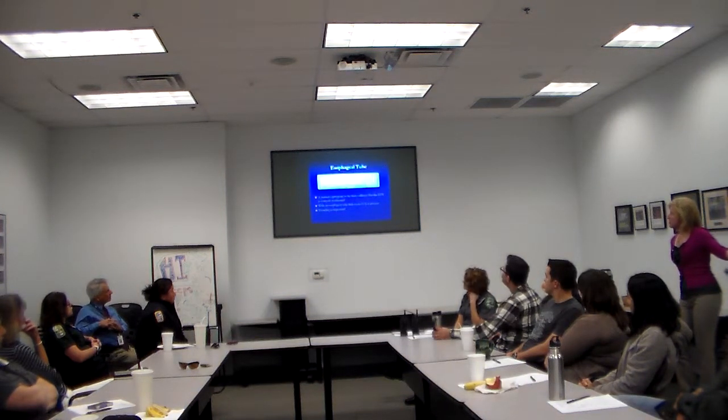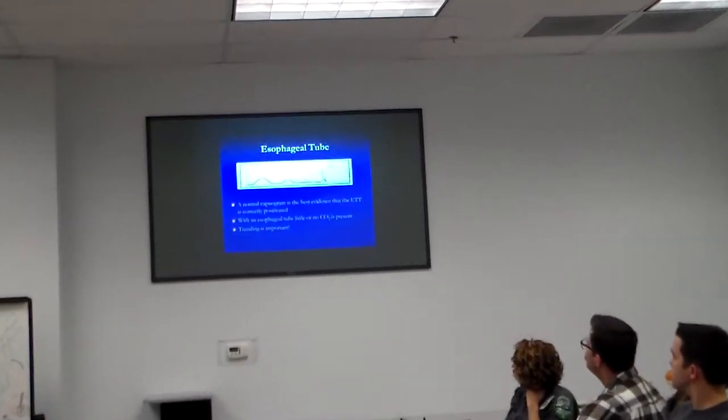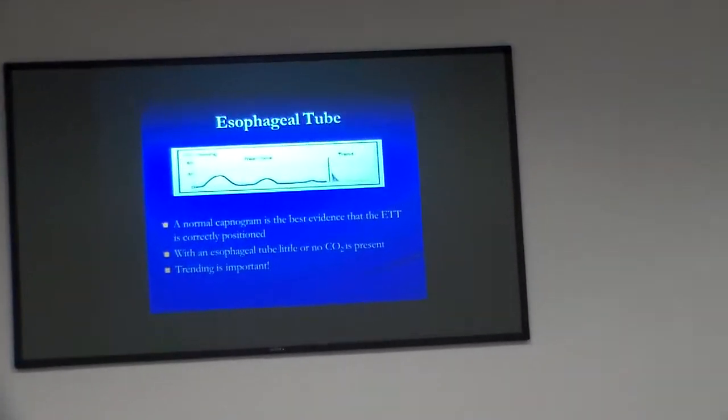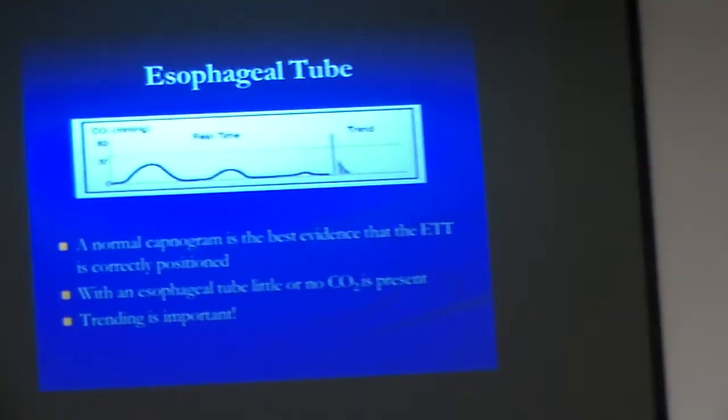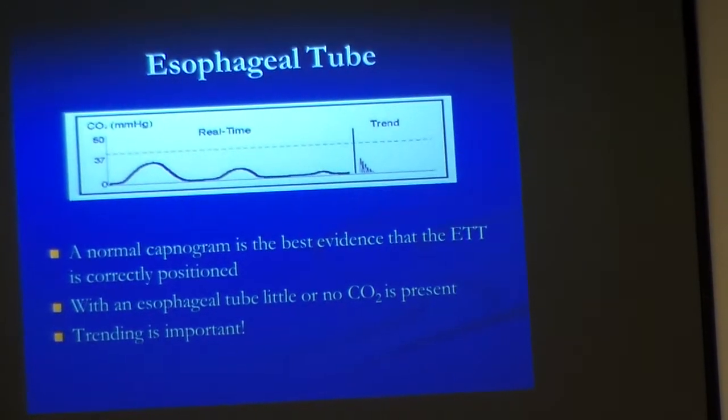Okay, that's an esophageal intubation. So like Dr. Georgie was talking about, you'll initially get this little whiff, little puff of CO2, and then it's like, oh, that's not good. So that's more than likely what you're going to see.